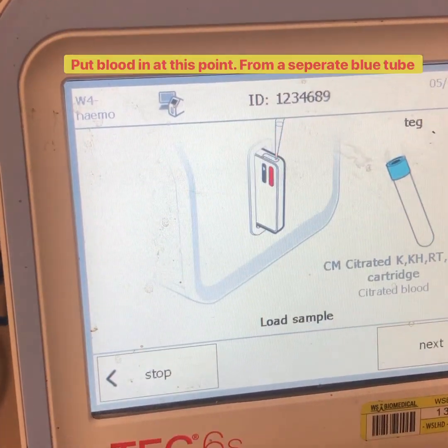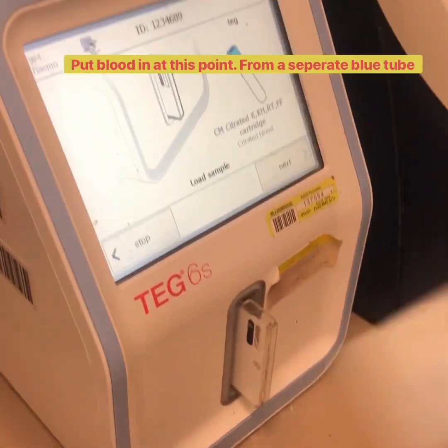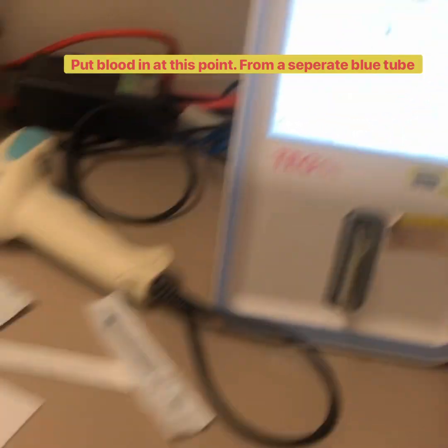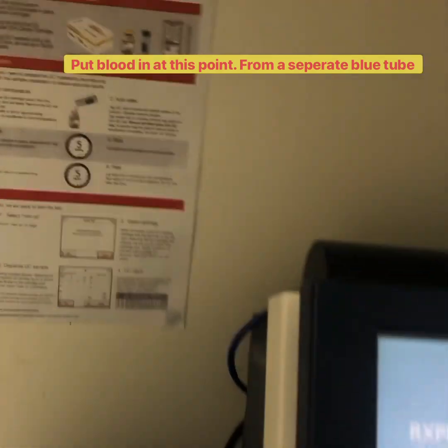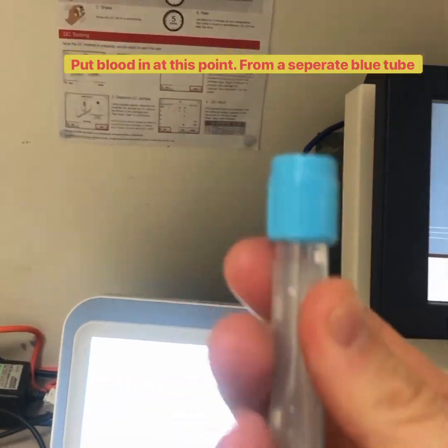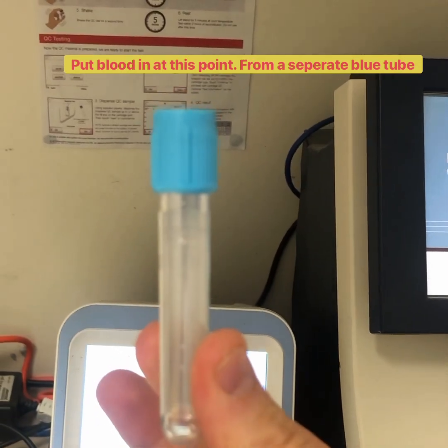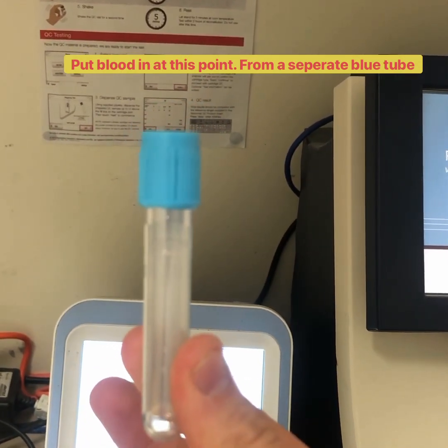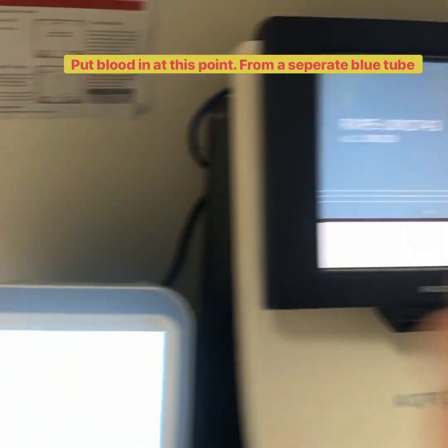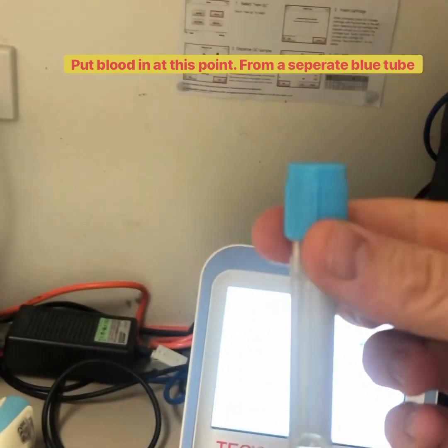Now it's asking for the blood. For the blood, we need a 1ml syringe or a pipette, which can be taken either out of one of these available blue tubes, or just take a spare coag tube. When you remove 1ml of blood from the coag tube it won't be up to the line anymore, so you need two coag tubes — one for the formal coag test and one for the TEG.